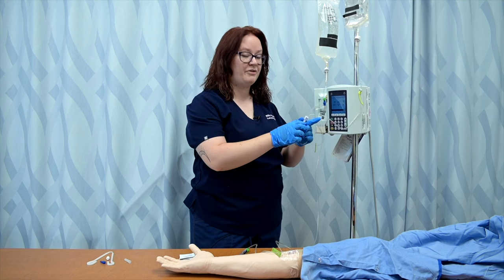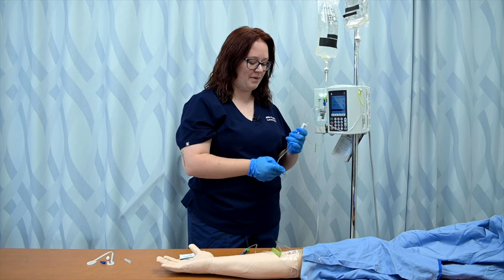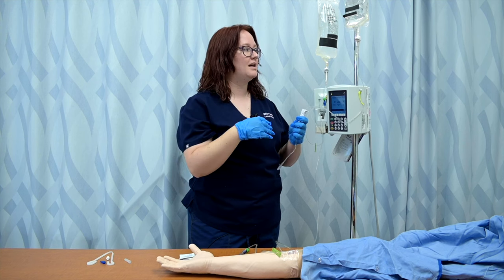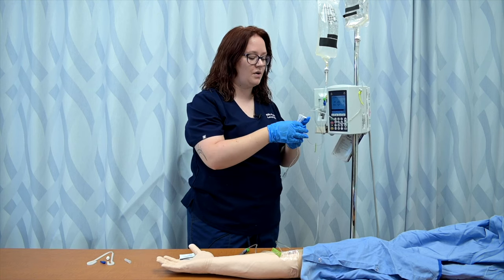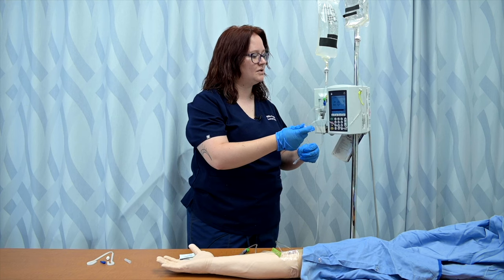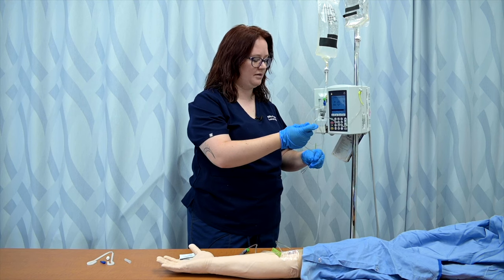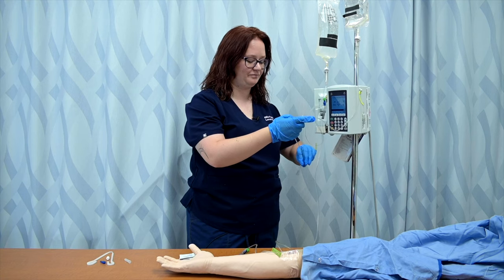Now, for this next step of priming the tube, I want to have good control over my roller clamp. If I just open up my roller clamp, this fluid will just wildly shoot out the end of the tubing. And I'm going to end up wasting whatever's in that bag and not know how much I've wasted. So I need to very carefully unroll this clamp slowly while I'm watching the drip chamber release the fluid, so that once it starts to release, I have control over it so it doesn't do that and I only waste a little bit of the medication.